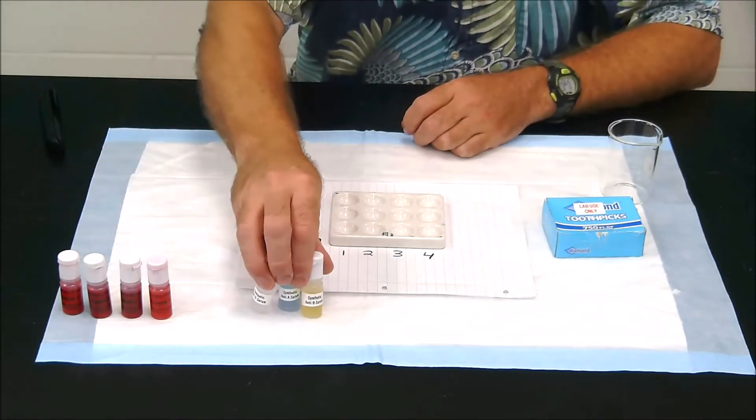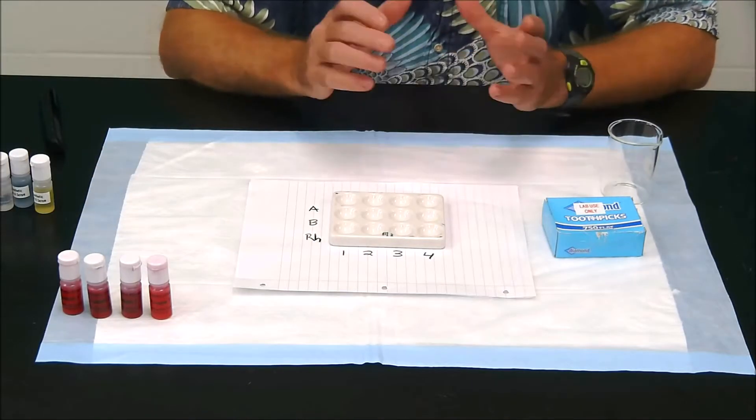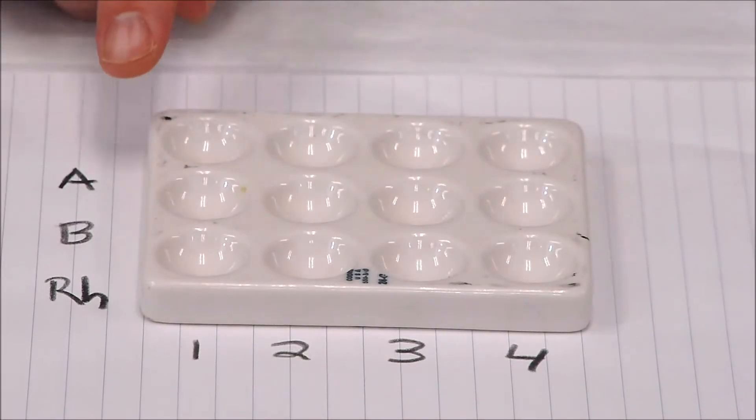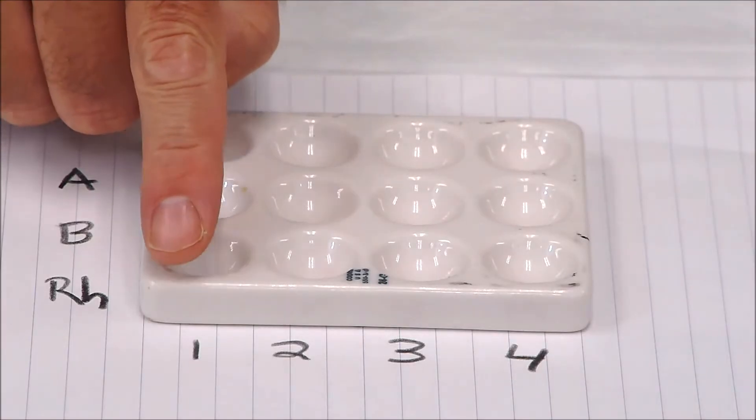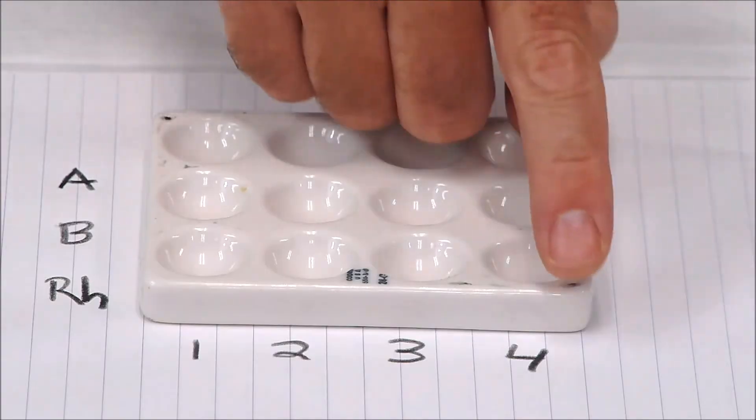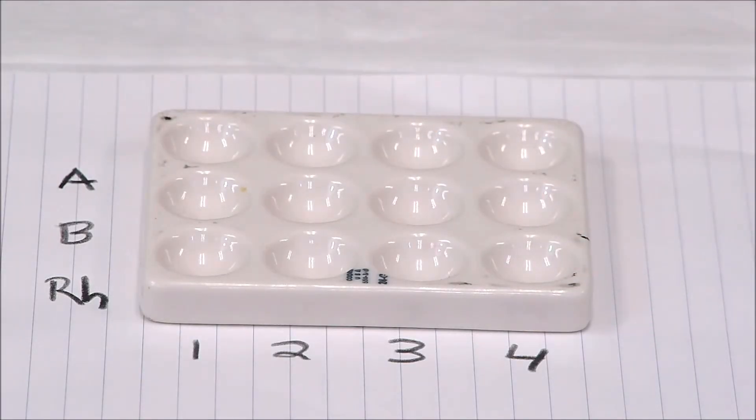So what we're going to do first is go ahead and label the wells of our blood typing plate. What you can see here is we already have those wells labeled, so we have sample one, sample two, sample three, and sample four. These will be our mystery blood samples.